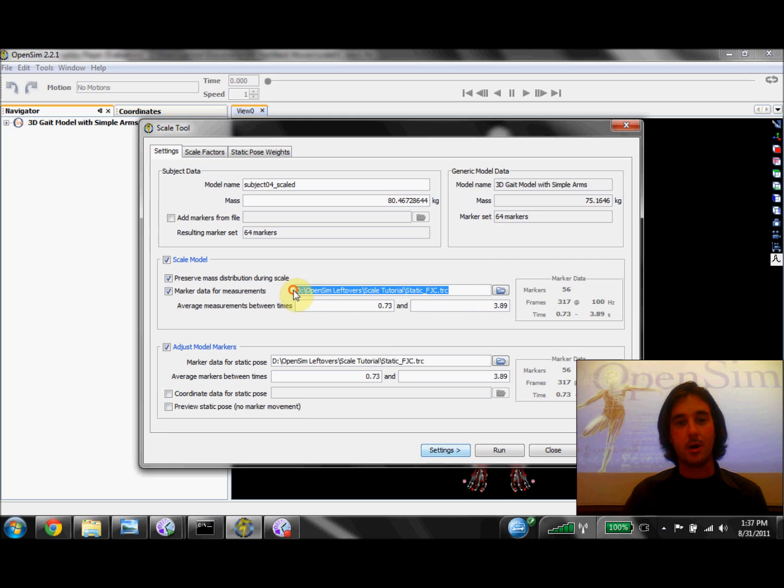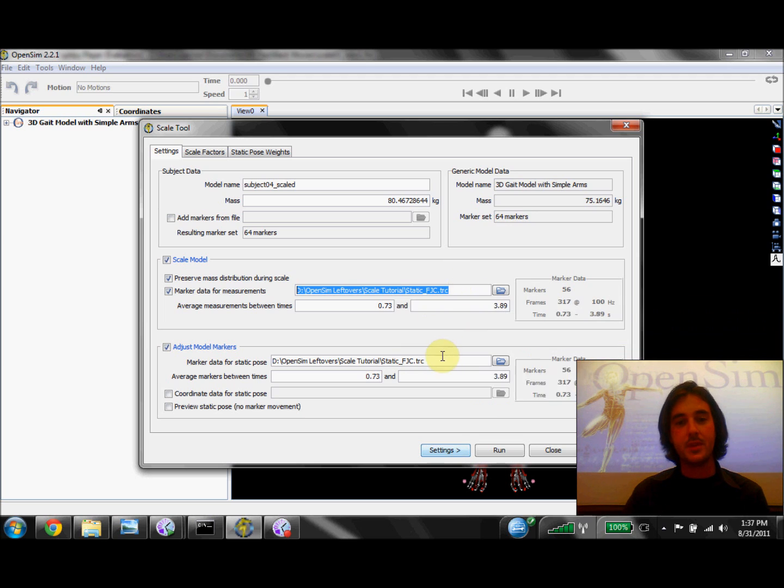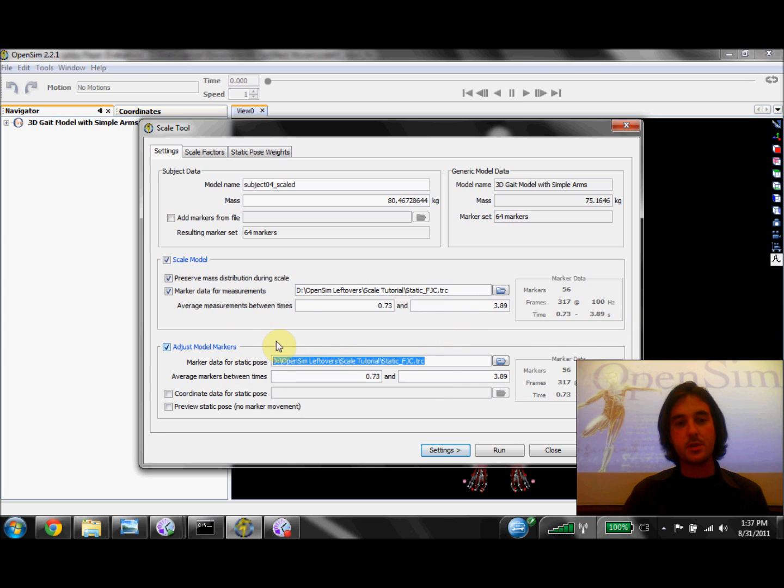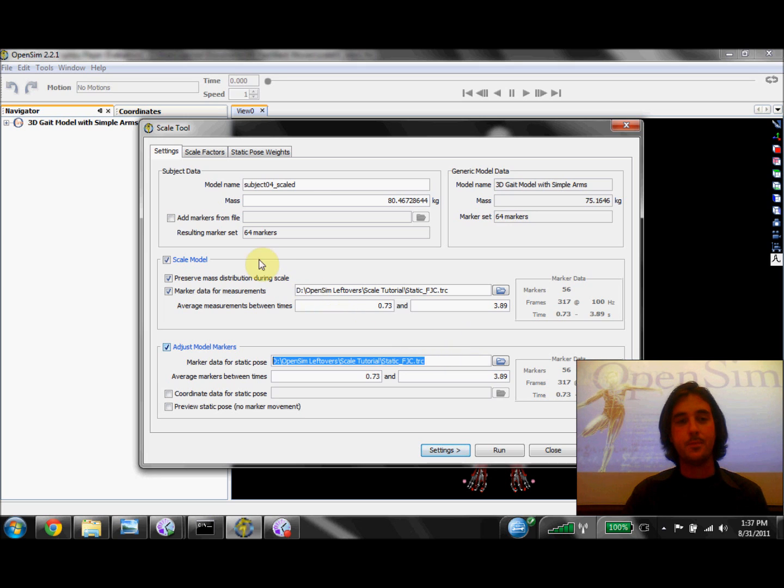First, here under Scale Model, which means that this data is going to be used to calculate the scale factors for each of the segments in the model. And then here under Adjust Model Markers, which means this data is going to be used to calculate the static pose or configuration that our subject was in during the static trial.